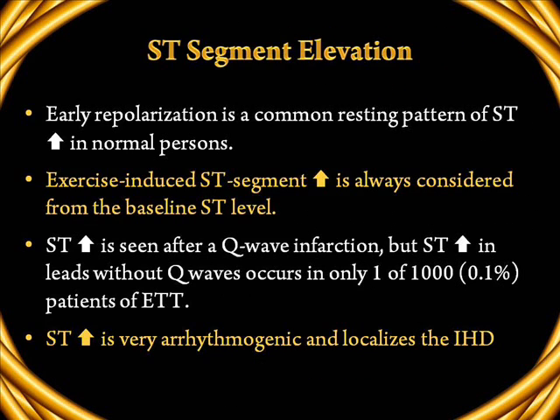How about ST segment elevation during exercise? Early repolarization is a common resting pattern of ST elevation in normal persons. It is not significant of ischemia. Exercise induced ST segment elevation is always considered from the baseline ST level. ST segment elevation is seen after a Q wave infarction, but ST elevation in leads without Q waves occurs in only 1 in 1000 or 0.1% of the patients on exercise test.